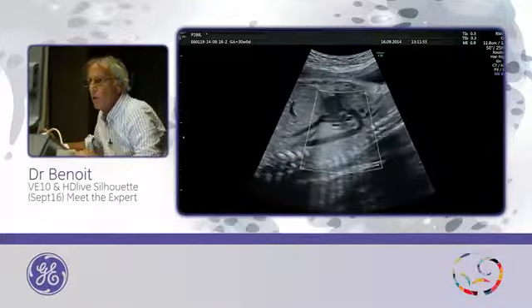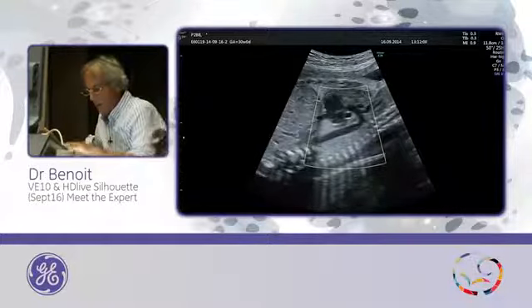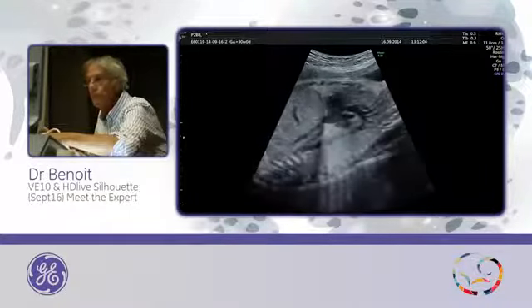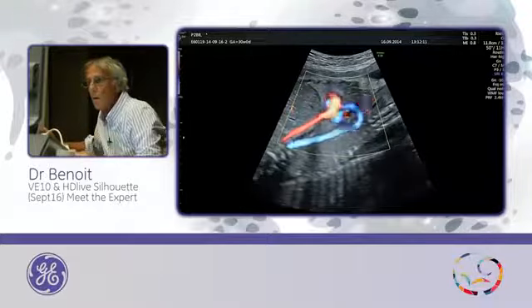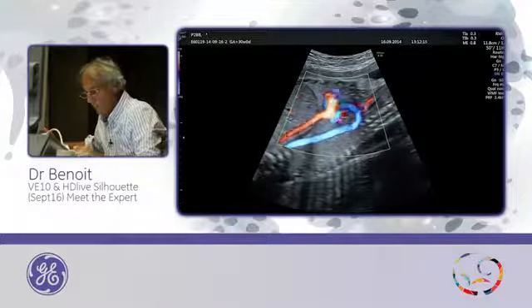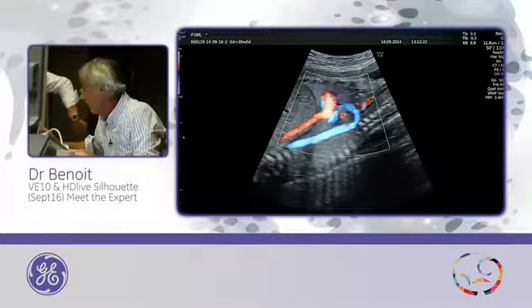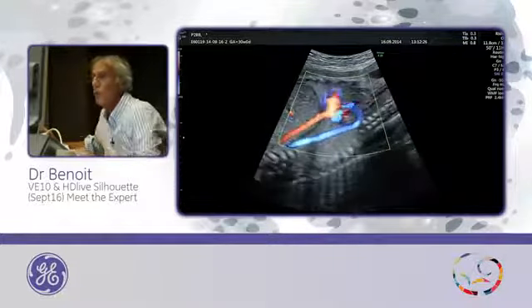So we will do a nice view of the aortic arch. Okay, I will do it with a static. I have 17 minutes until? It's now 1:15, so until 1:30. It finishes at 1:30. Okay, so I do this and then we'll open some cases.